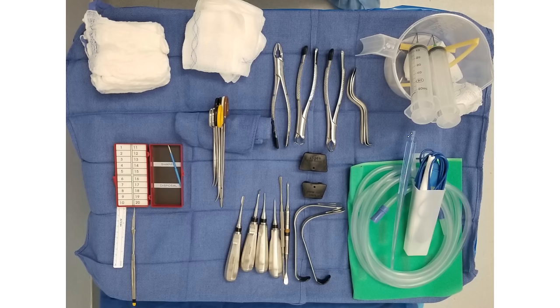This is a suction tube. This is a Yankauer suction. This is a Bovie electrocautery. So it's got a little holster, and then it's got the cautery here with the wire that plugs into the machine. These are mouth props. They're just bite blocks. And we put those between the teeth to hold the patient's mouth open.